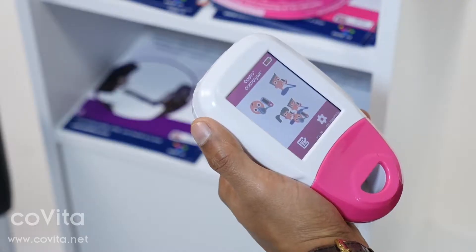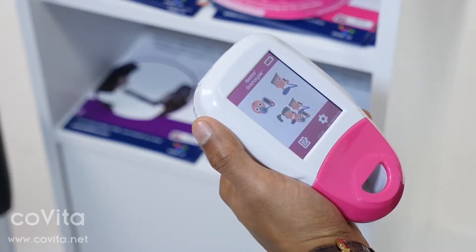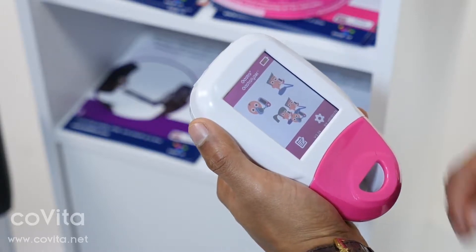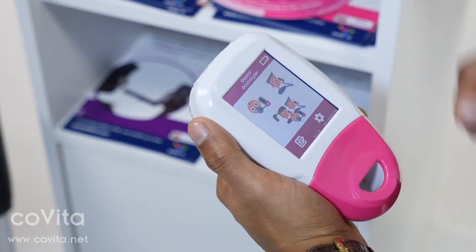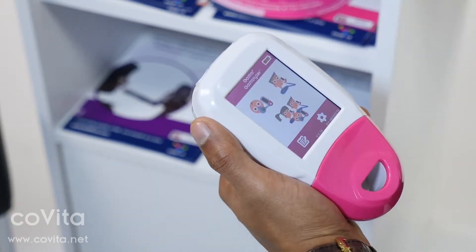The Gastro Plus has three breath testing options: a face mask breath test, a mouthpiece breath test, or a protocol breath test.